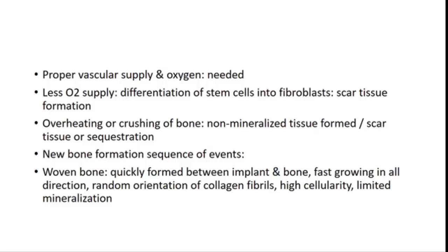So keep the drilling slow and sustained, depending on the type of bone you drill and the type of implant system you're using. I hope you understand the term osteotomy.